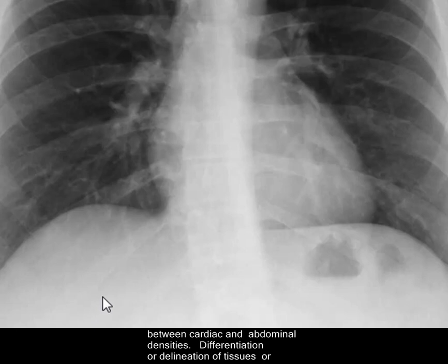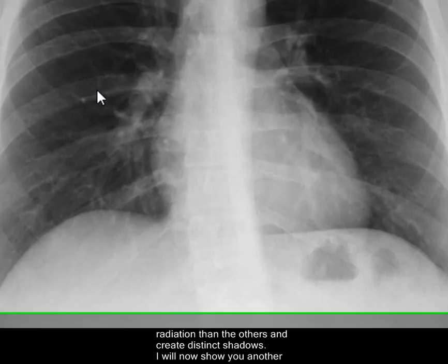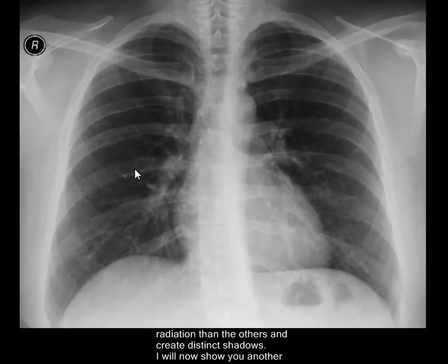Differentiation or delineation of tissues or organs on X-rays is only possible because of differences in densities. Some absorb more radiation and some absorb less radiation than others, and create distinct shadows.